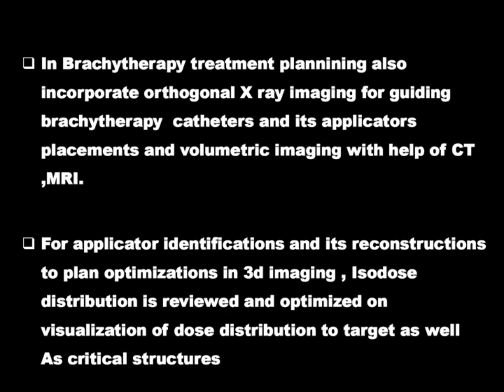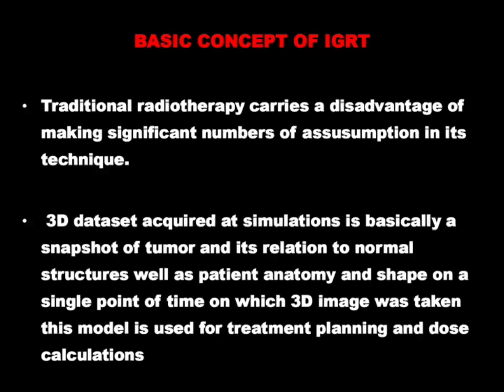So a CT scan nowadays is fully built with the KV imaging system, even the megavoltage and kilovoltage imaging systems, as well as the electronic portal imaging devices, and then also a respiratory sensor imaging system, and the real-time 3D methods.